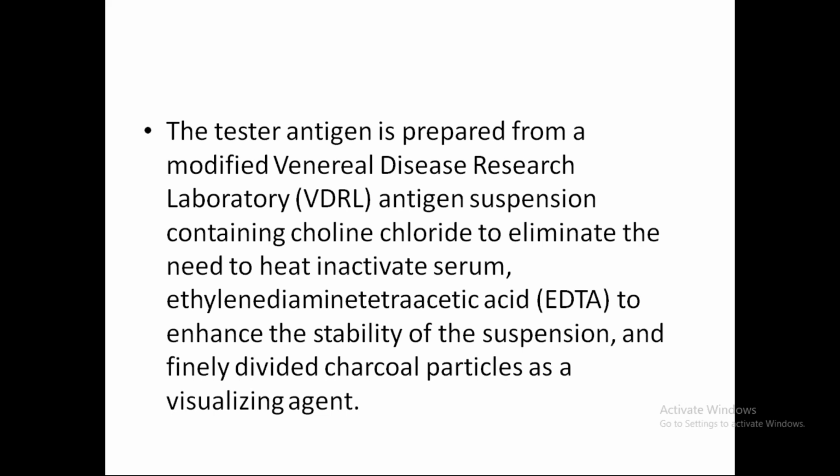The antigen is prepared from modified VDRL antigen suspension containing choline chloride to eliminate the need to heat inactivate serum, ethylenediaminetetraacetic acid (EDTA) to enhance the stability of the suspension, and finely divided charcoal particles as a visualizing agent.